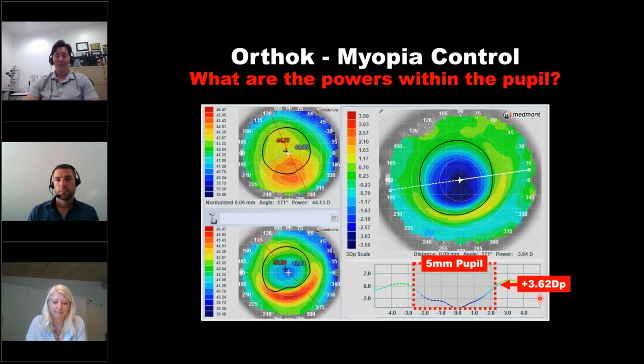So Meta, for myopia control, we have Orthok, we have soft lenses, even glasses are used today for myopia control. What plus should we be using within the optic space that we have to create good myopia control? It's a very good question, and the adequate amount of plus has been discussed as long as myopia management has taken place. There's a lot of different opinions on this subject, but what we know is that we cannot have too much plus in the periphery. So the short answer is as much as possible.